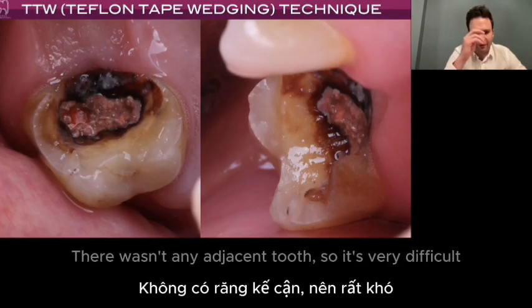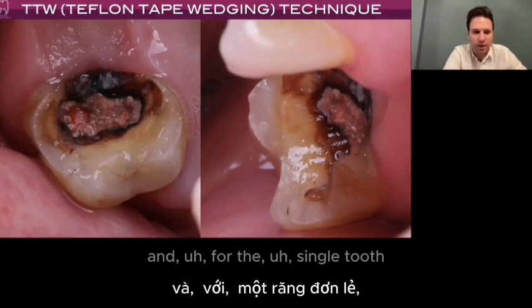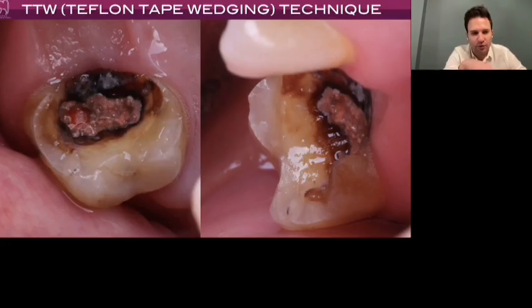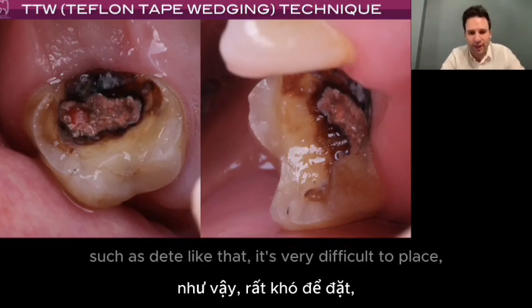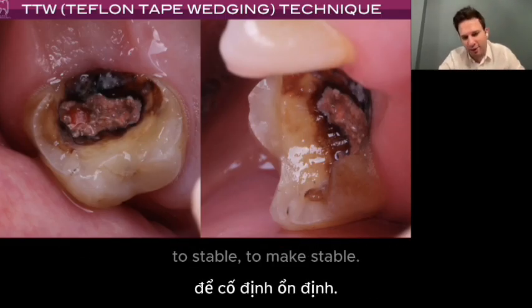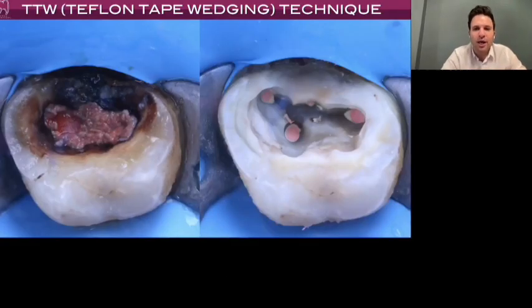For this patient, there wasn't any adjacent tooth, so it's very difficult to stabilize your matrix system. For a single tooth, especially one which has very deep cavities, deep caries, like that tooth, it's very difficult to make your rubber dam clamp or your matrix clamp stable.